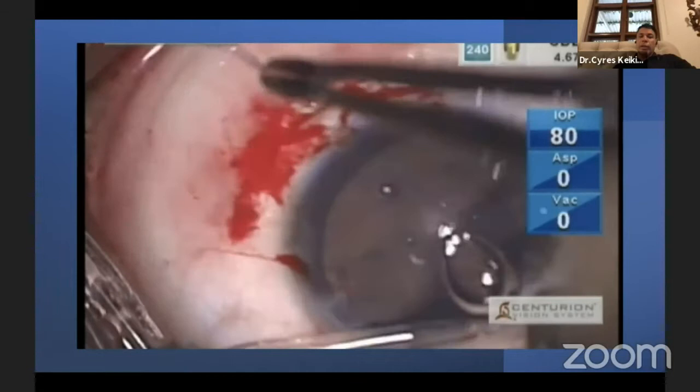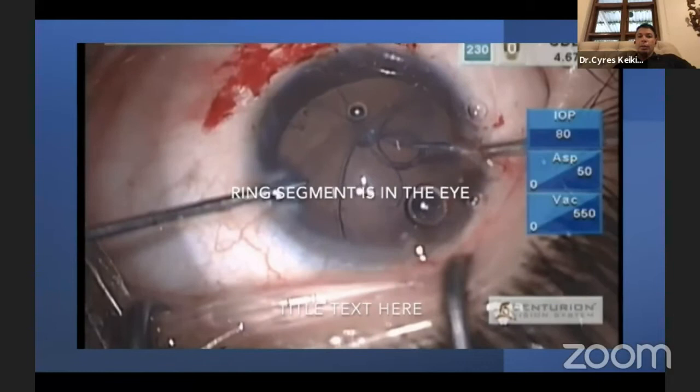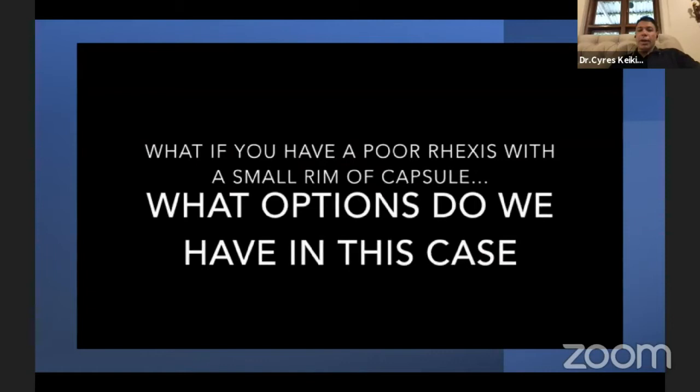This is an Ahmed segment, which we railroad out of the eye — very simple. You connect the Prolene to the segment. You don't even have to tie a knot because it's double-armed. You get the ring segment into the eye after railroading the needle out in the standard procedure, tie it tight, and also put in a capsular tension ring to support the entire lens so it centers very nicely.